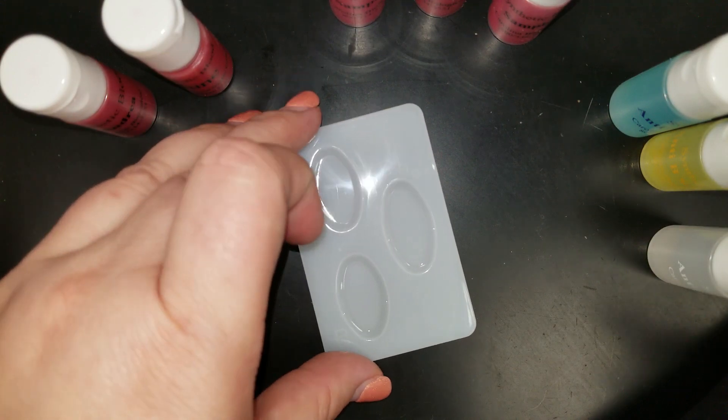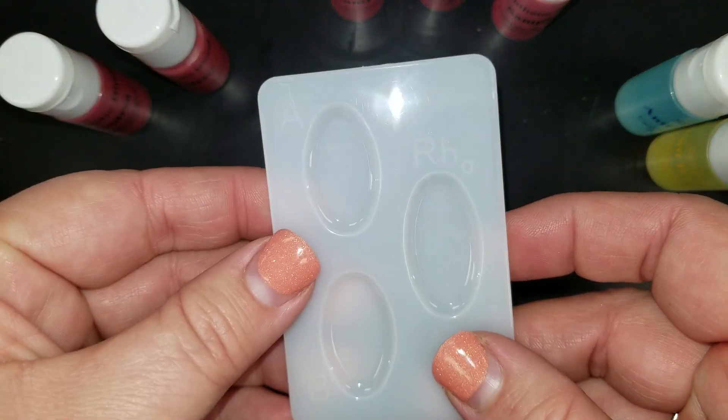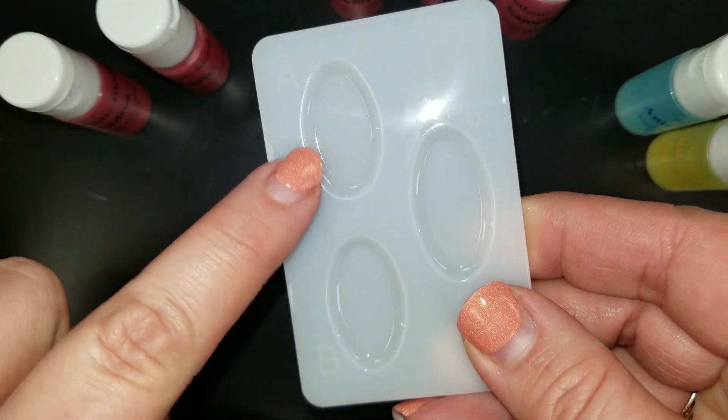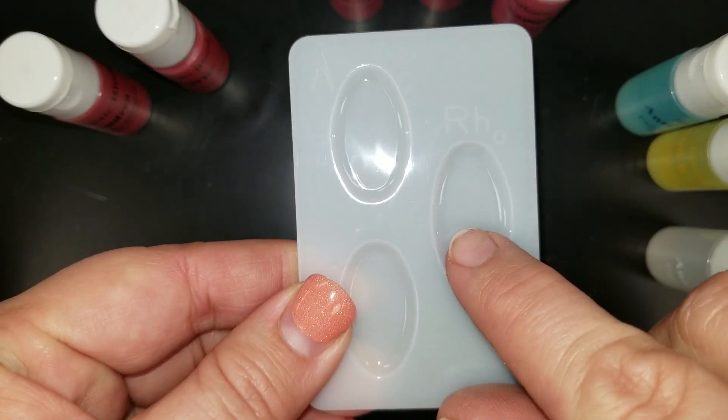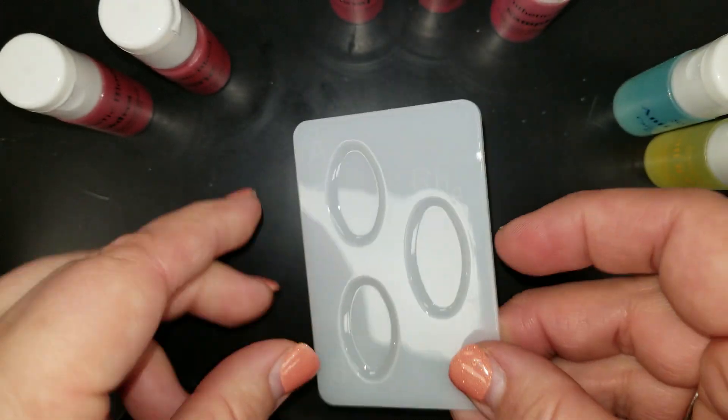Then you have your testing tray here. And it's labeled for you where you're going to do your anti-A test, your anti-B test, and your RH test. So each of these trays are labeled for you.